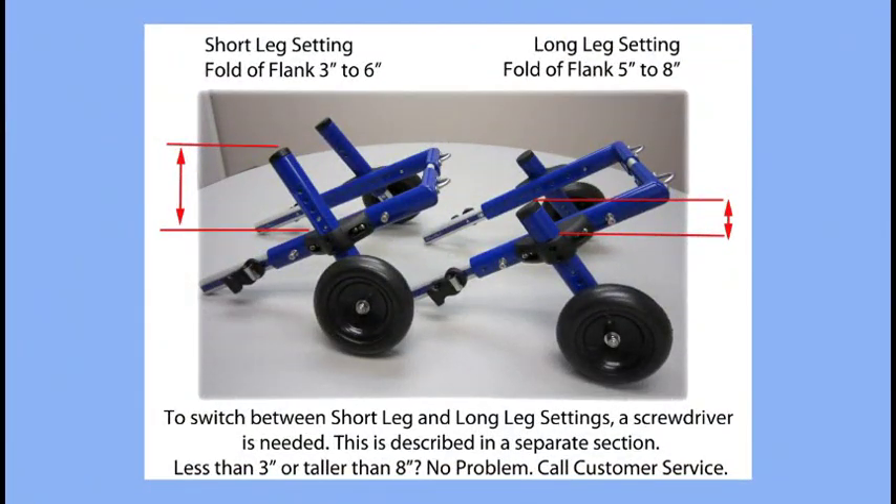The wheel struts slide up and down inside the wheel leg to adjust the height. For more flexibility, the legs themselves can be moved up and down using a Phillips head screwdriver. On the left, the legs are on the shorter leg setting. On the right, the legs have been adjusted for longer-legged dogs. If you need to make this adjustment, there's a separate video that shows you how.